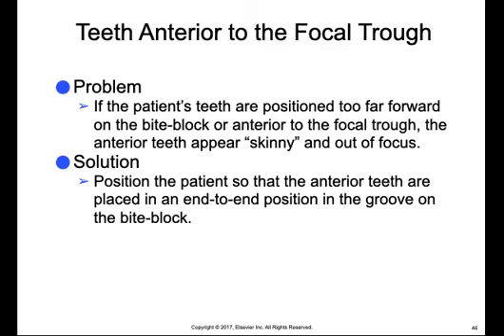If we look on page 236, figure 22-5, in the beginning of the chapter, we can see a picture of what that focal trough looks like. You can imagine a little tank of water where the water, of course, would be level with the floor. We have to make sure that the focal trough, or your patient's mandible, is positioned in that area. This is that imaginary curved space that's shaped like a horseshoe.